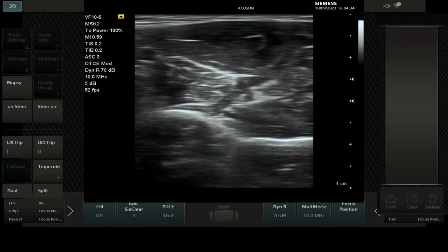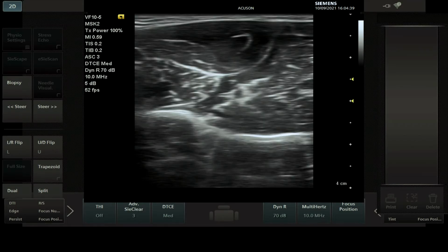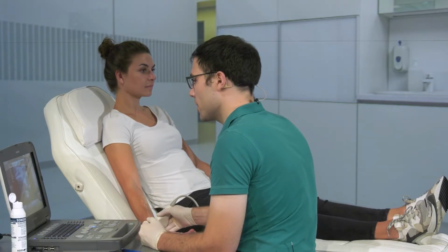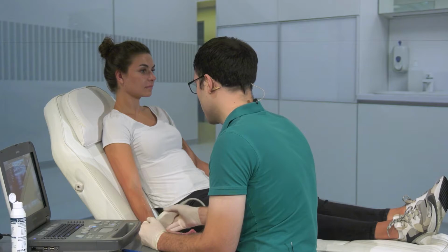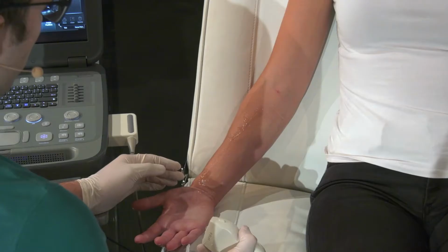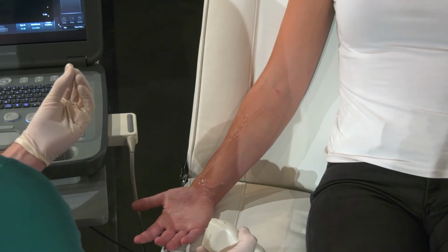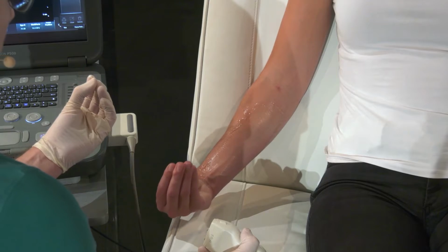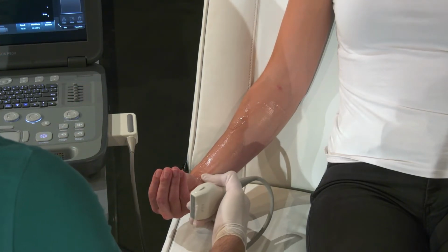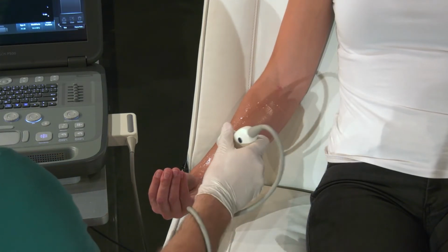Consider that some muscles may need several injections depending on the volume you want to inject. And also consider anatomic variants, like, for example, the palmaris longus, which can be seen here in Annika. Annika, could you please just move your finger like this? And here the palmaris longus can be seen. In some patients, you won't see this muscle.